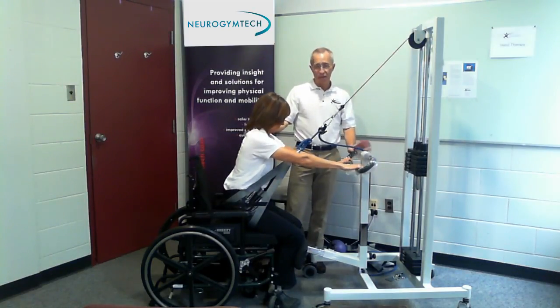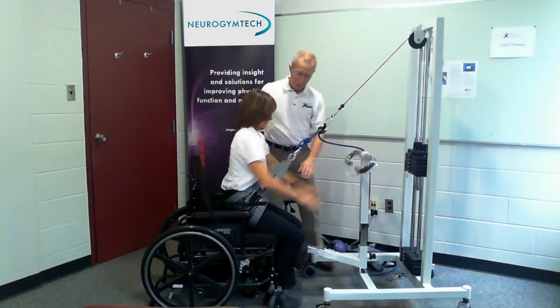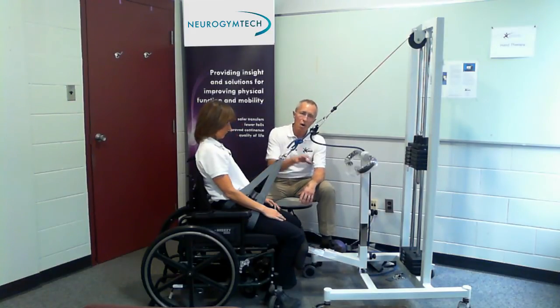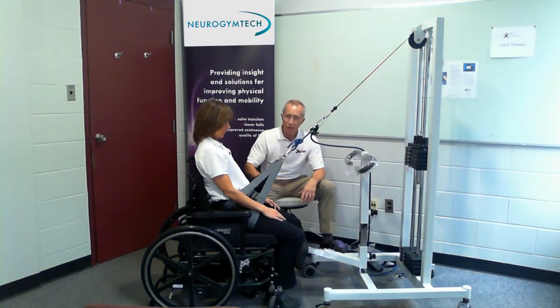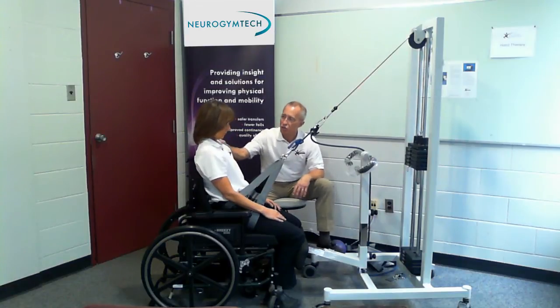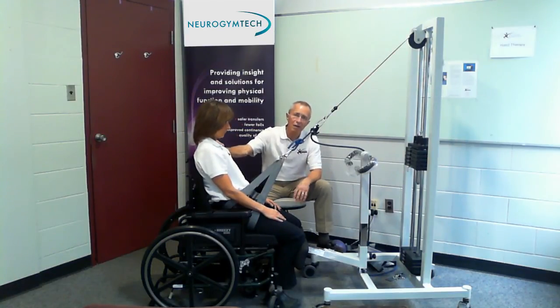You'll be surprised how quickly they kind of get it. Then it's a numbers game — you try to do as many as you can, three sets of ten, or start experimenting with how many they can do in a minute. A couple of hints for cognitively impaired patients: if they're afraid, let them watch two or three other people in the machine being successful first, so they know what it looks like. When you put them in, try putting on some music, stay close to them, rub their shoulders and talk to them. In our experience we've had great success with people you wouldn't otherwise think of standing because they're either too large or don't understand commands.